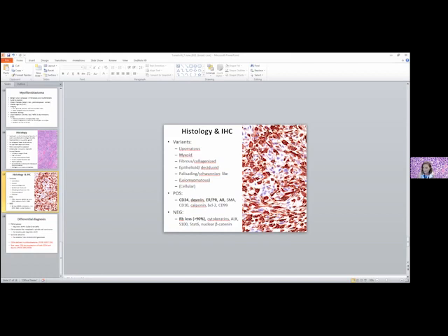They've been described as case reports in the breast, and they've also been described in the vulva. Arguably, again, this case could probably fall under the cellular myofibroblastoma category. Most cases are CD34 and desmin positive. So 80 to 90% will co-express CD34 and desmin. Most cases will usually also express ER and PR. Those are usually diffuse and strong, as was in our case.